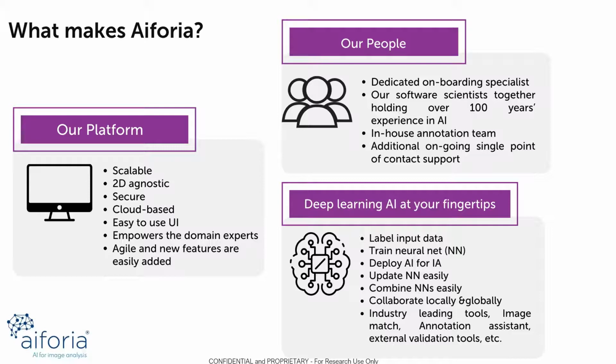And because we are cloud-based, this means that you can collaborate not only locally, but globally. And again, we do have industry-leading tools like our image match, which we'll show in a later webinar, our Annotation Assistant, which is our patented active learning tool, which you'll see today, as well as our external validation.